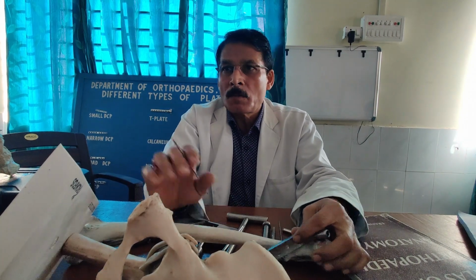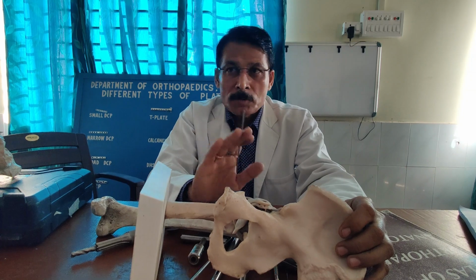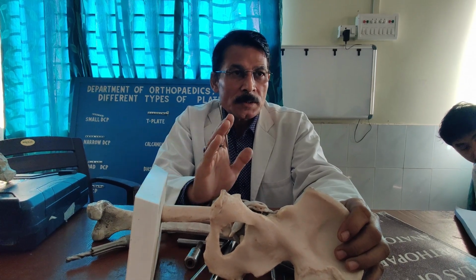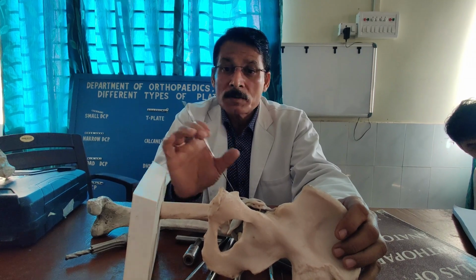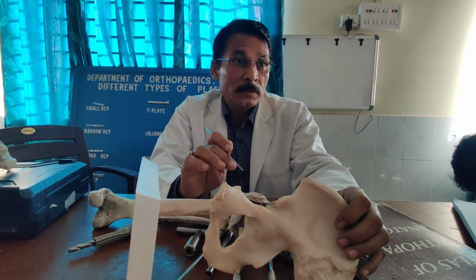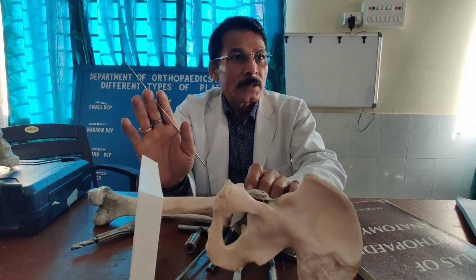So how to start now? These are the principles. They should be adhered to in all the cases: what implants you are going to select, what should be the length of the screw, what my plate will be, where I am going to place the guide wire. That is very important, and subsequent things are there.